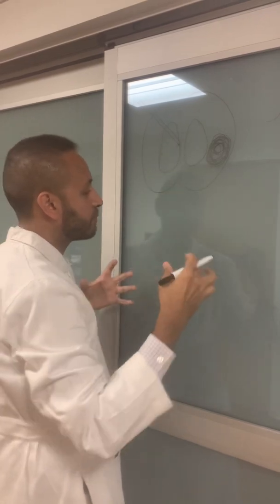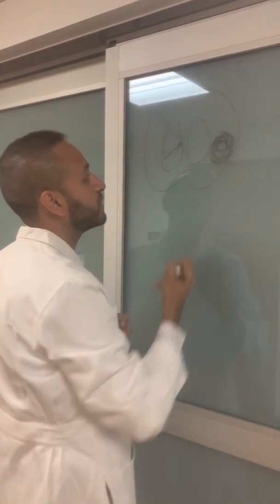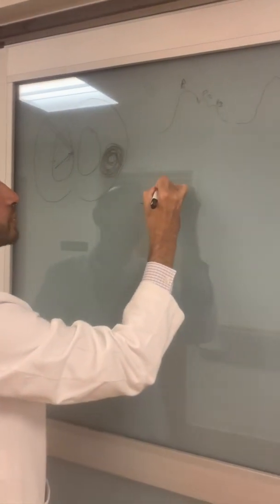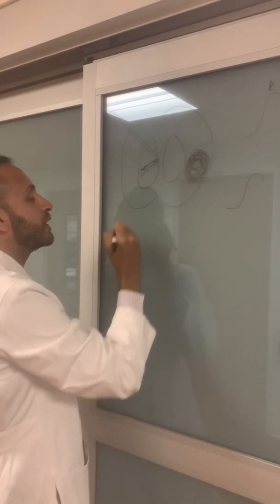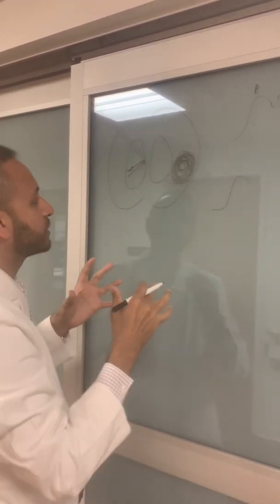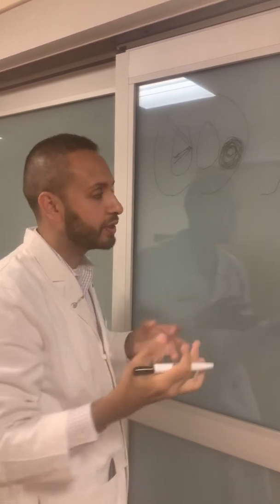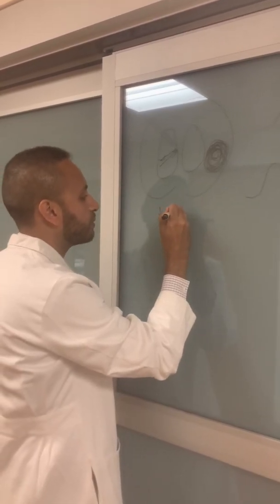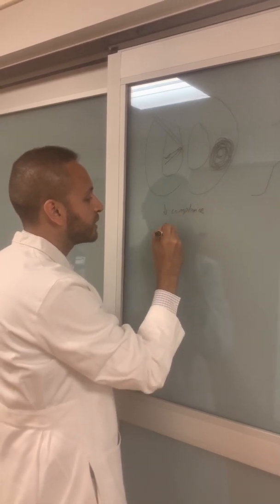Your heart pumps, you get your initial wave to the EVD, your initial P1. Now that energy is hit back to the brain parenchyma through the vasculature. The brain is very tense. It's non-compliant at this point, so when you decrease compliance, you increase elastance.